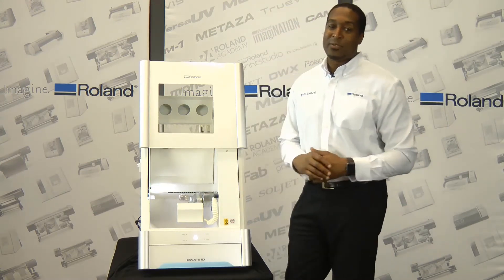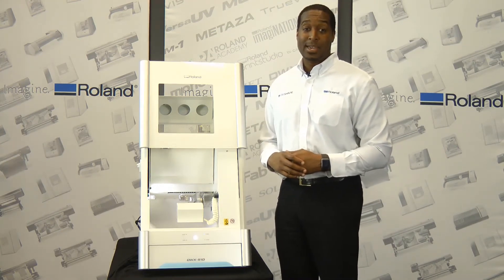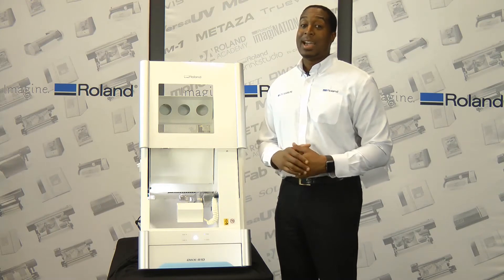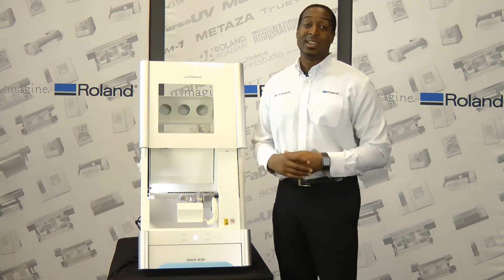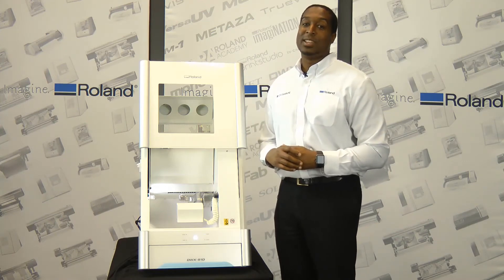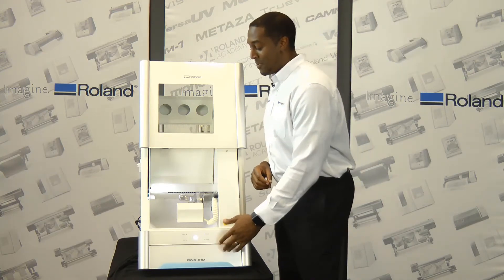The DWX51D can mill zirconia, wax, PMMA, PEEK, gypsum, and composite resin materials. It is the first Dental Dry Mill approved for milling Vita Enamic, and you have the choice to use disc or pen-type materials.